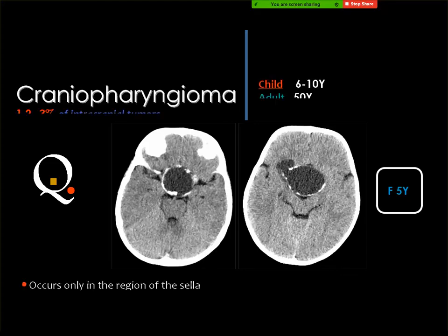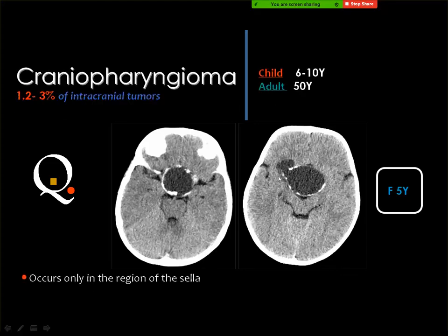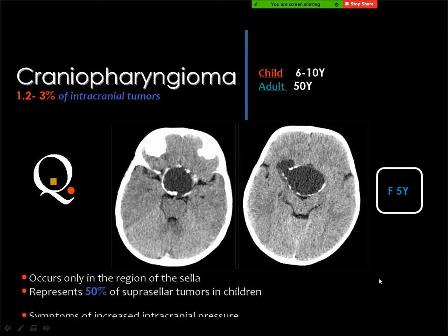Craniopharyngioma. Yes, and this is craniopharyngioma. We have three criteria: cyst, calcification, and solid mural nodule. Two of the three criteria are enough, but the cyst should be one of the two. When you see a cyst with calcium, it is enough to diagnose craniopharyngioma in the suprasellar area.